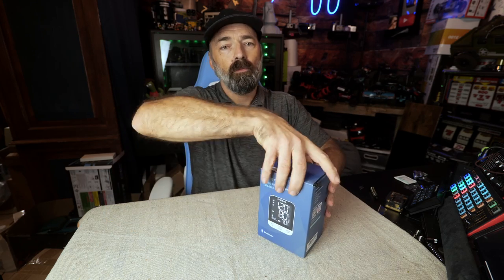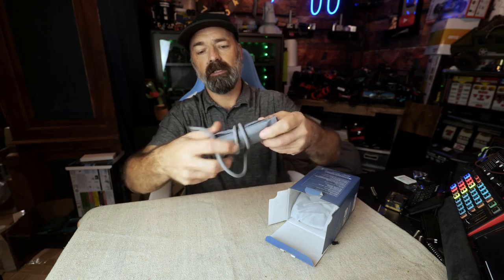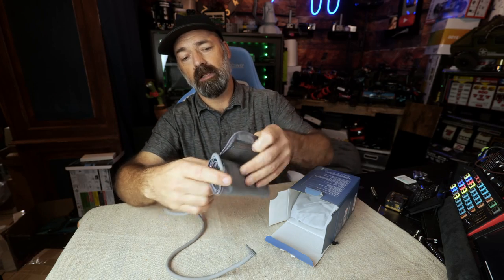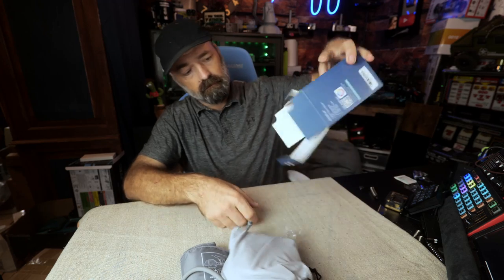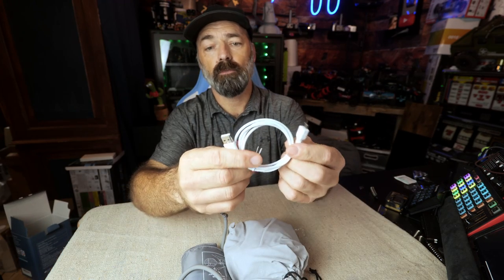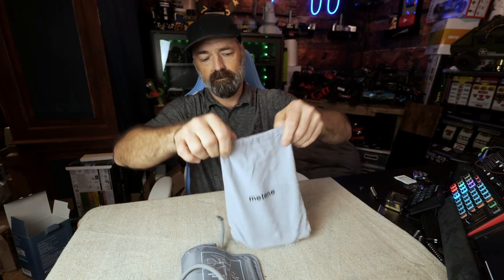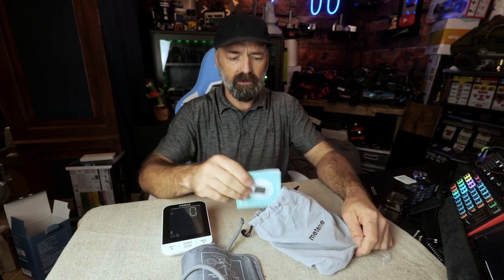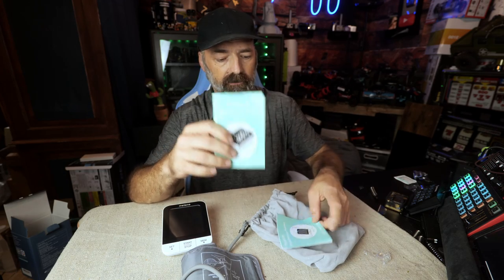Let's open it up and see what comes in the package. You're going to get an adult size cuff — it says adult large, 22 to 42 centimeters — and you have the cord for it so you can connect it to your computer or your phone.